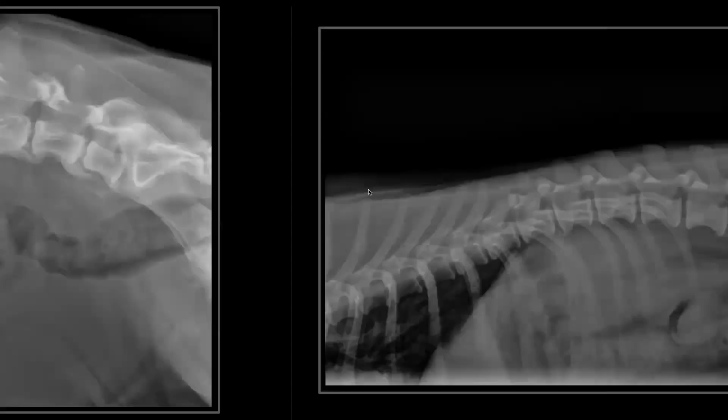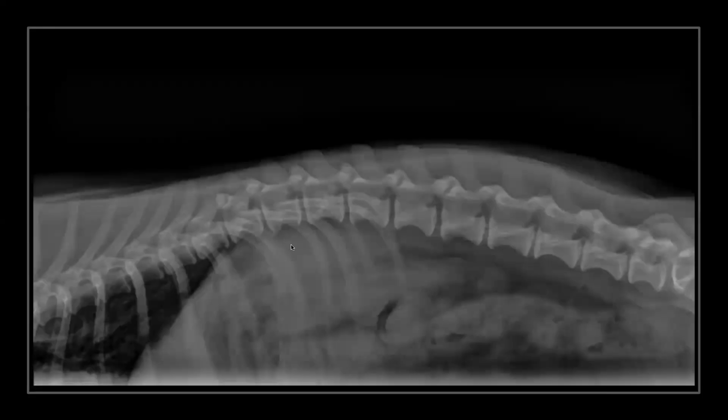This is a case that is probably a young patient. And if you look at spondylosis, the film may have been taken for other reasons. However, we can find spondylosis right here in a much earlier stage. What is this? T13, T12. A common place, not on this patient, but another common place in the early stages where we often see it is the sacral region.